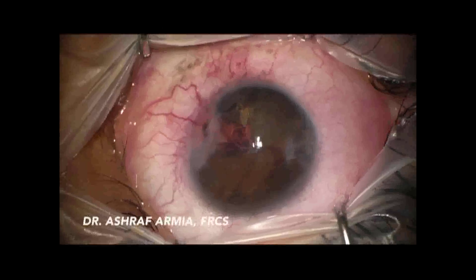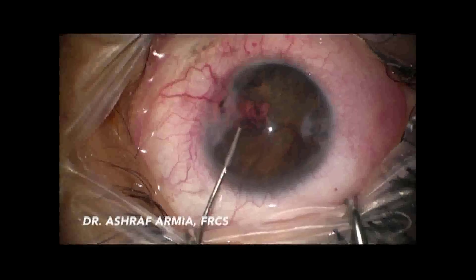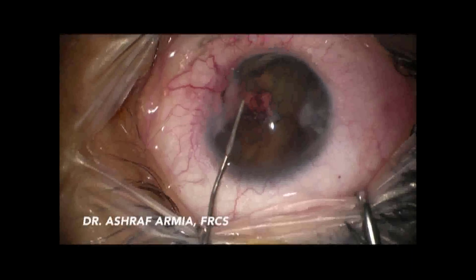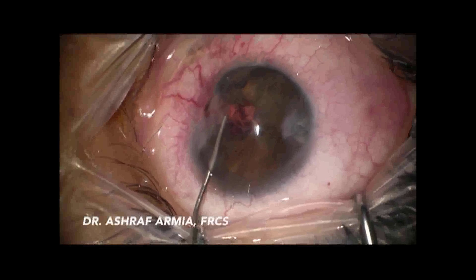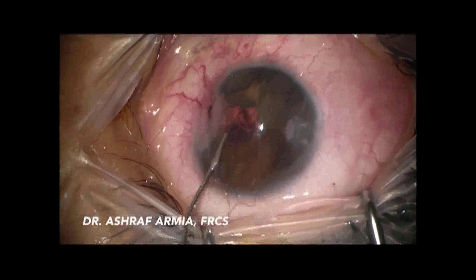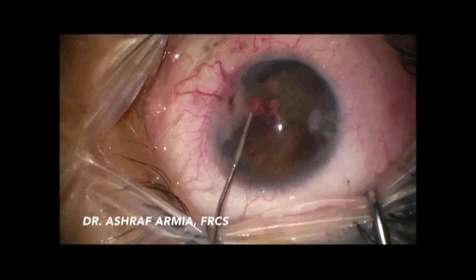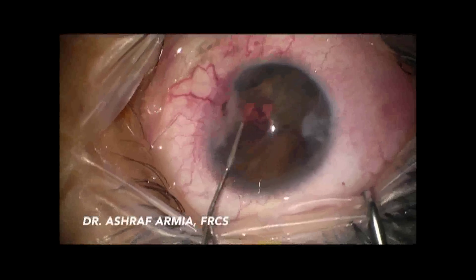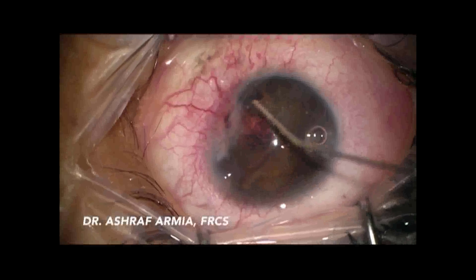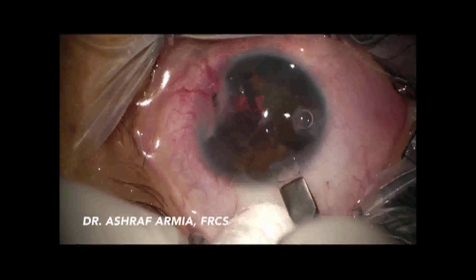I started the operation with two paracenteses of 1.2 mm, then injected a double coat of viscoelastic to protect the cornea. With a viscoelastic cannula, I began to discover what the orange color I was seeing was. I realized it was a foreign body impacted from the limbus, entangling the iris tissue.